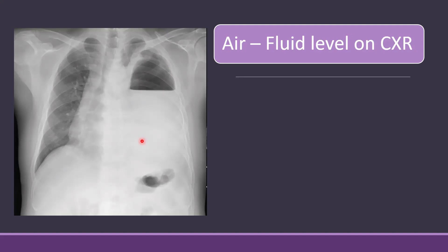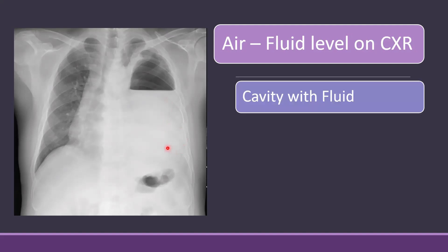If we discuss the causes of this air fluid level, a common cause is a cavity with fluid — fluid settles down, air rises to the top, and it gives the appearance of an air fluid level. The causes of a cavity with an air fluid level can be an abscess or it can be cancer, along with certain other causes.